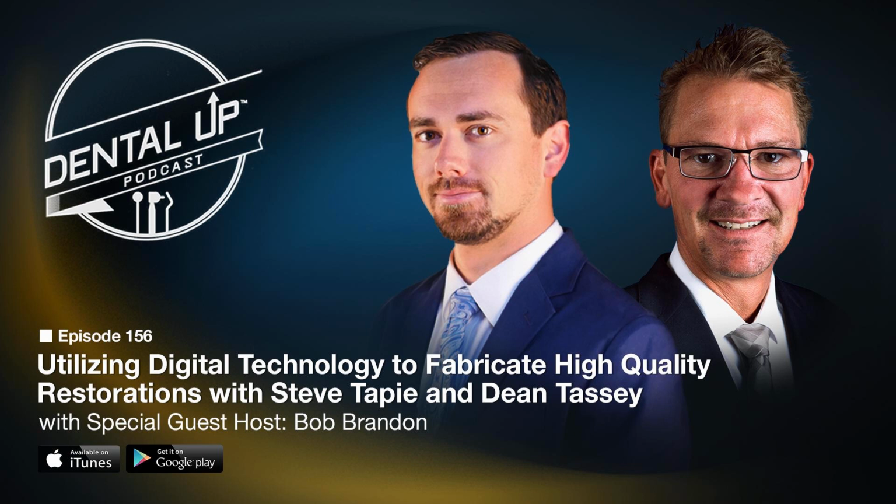Absolutely. Excellent. So, again, in doing our research, we looked at 2 or 3 different systems that were milling dentures. And the subtractive method of fabrication was, to me personally, not a very attractive or cost-effective option. What are your thoughts on that? I agree. We tried at least 3 different versions and different pucks, and we just never got the really good, consistent results that we wanted to put out there.